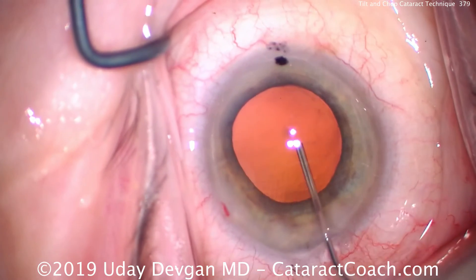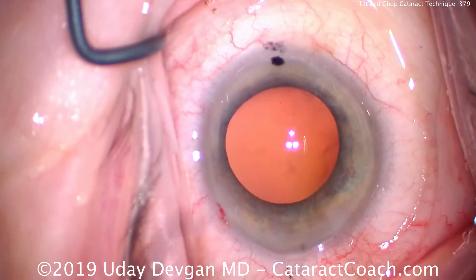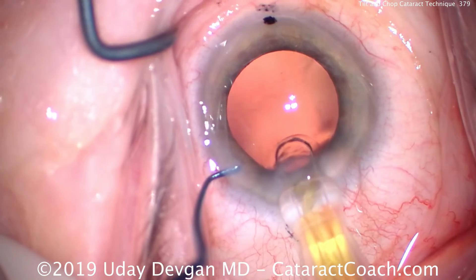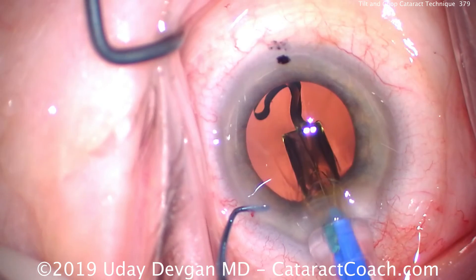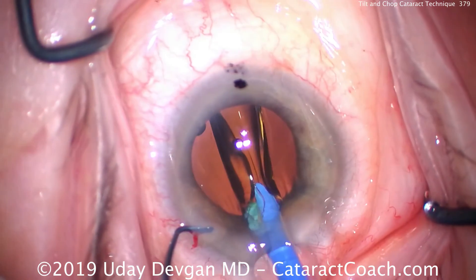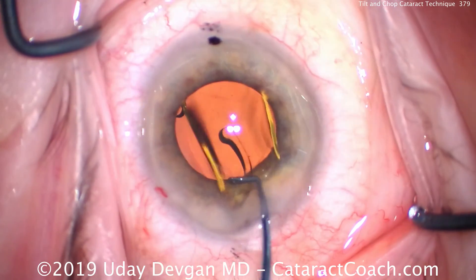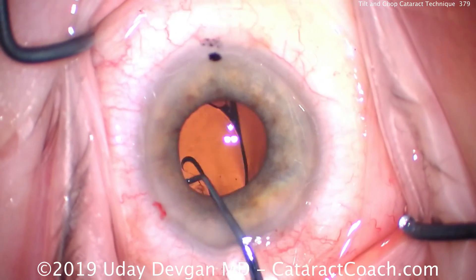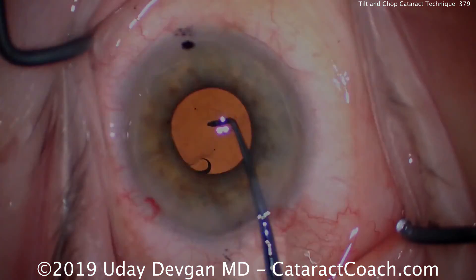There's the fill of viscoelastic, and you can see the outline of our capsulorrhexis. Now our single piece acrylic lens is going to be injected into the capsular bag — and that goes in nice and smoothly. There's the first haptic coming out. As you know, it should come out like the number 7, and the trailing haptic should come out like the uppercase L. So overall, the haptics are in the anti-S formation. Remember, S is a stupid mistake because the lens is upside down. And now as we open the lens, you can see just how small the eye is — that's a 6mm optic, but it looks positively huge in this eye.